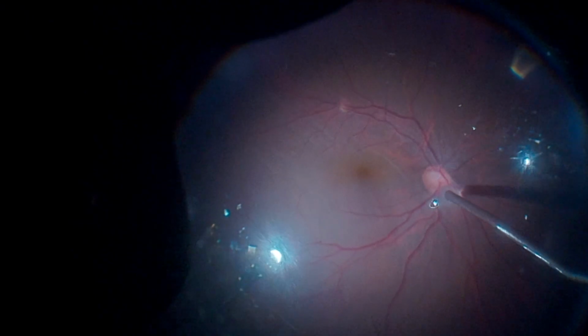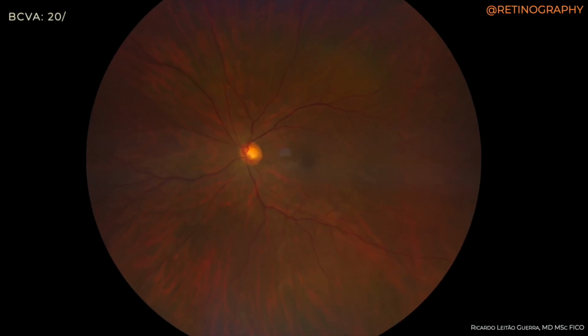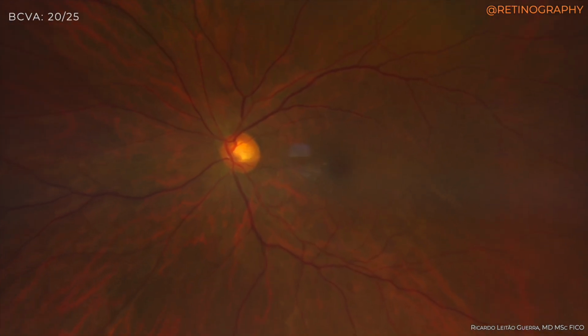SF6 gas at 20% was used at the end as a tamponade agent in this case, with excellent anatomical and functional results after 1 month of surgery.